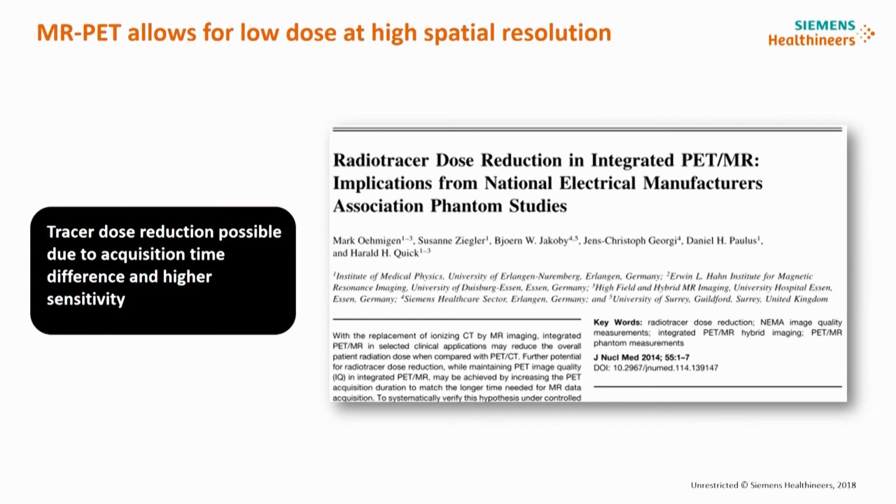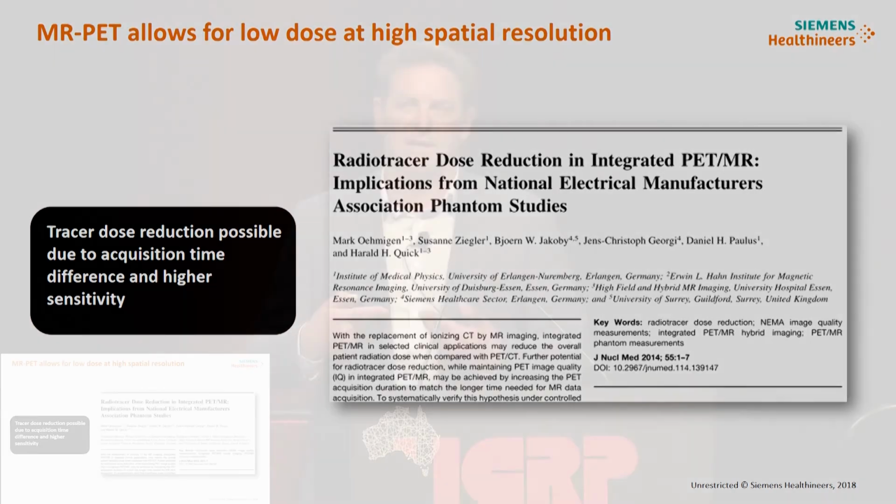And another one talks about the fact that MRI sequences run for a longer period of time, but we're acquiring PET data the entire time. So you don't need to inject anywhere near the activity to be able to get the same image quality on the PET-MR scanner.